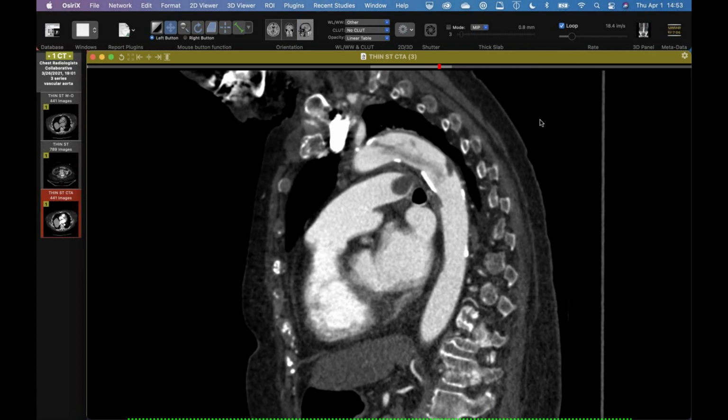Let's see, I have. It was interesting you showed that systemic to pulmonary artery collateral that you could see off the subclavian. Yeah. Because they're there all the time on angio. Something like 40% have coronary to pulmonary artery connections on angio, but we just never see them. So it's really cool that you actually could see it in that case.